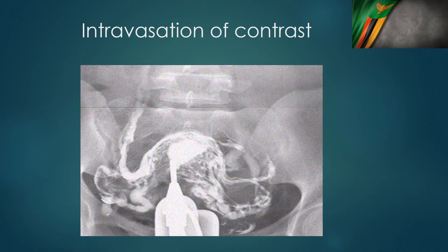This x-ray shows what can sometimes happen: when contrast is injected into the endometrial cavity with some resistance or force, it can enter the vascular system and look something like this. This is something you should not misinterpret — it is contrast that has gone into the intravascular space and is moving through the blood vessels.